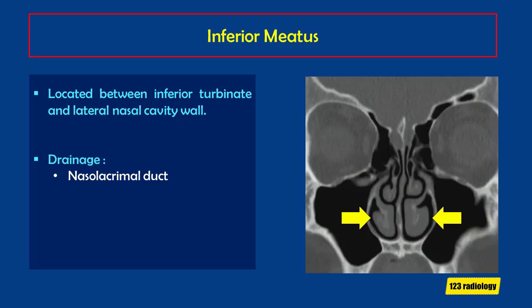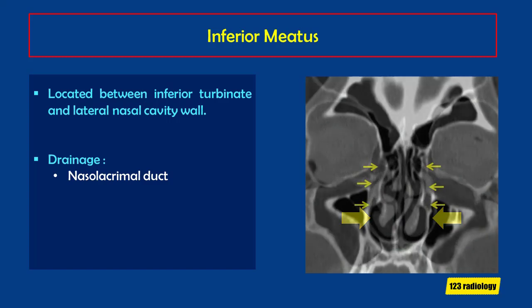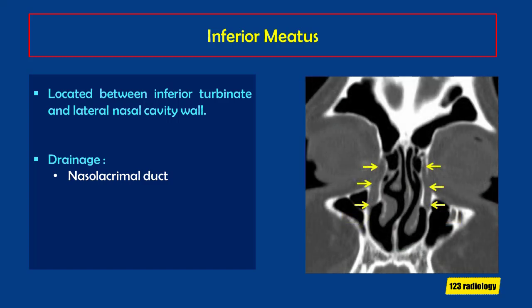The inferior meatus is found between the inferior turbinate and lateral nasal cavity wall. We can appreciate it well on coronal images. It receives drainage from the nasolacrimal duct.